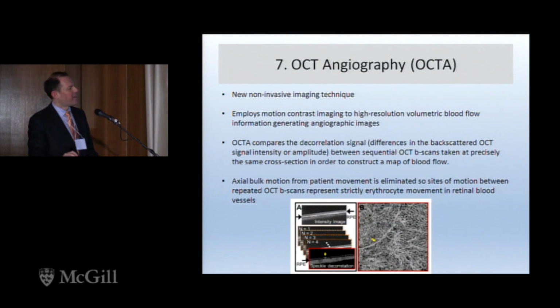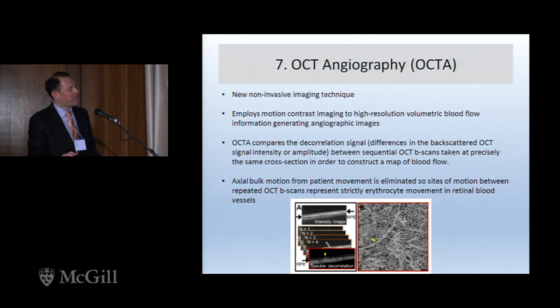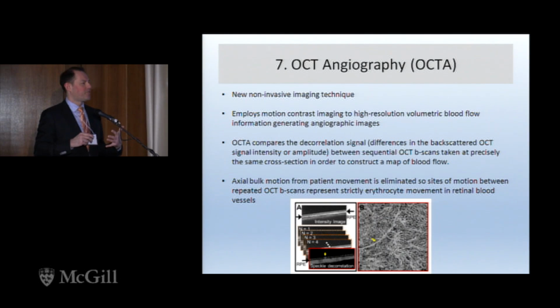I'll skip over that. And the last point I'll make is OCT angiography, which we'll hear in a little bit more detail with Dr. Moreno. This is one of the newer non-invasive imaging techniques, and in retina, this is the buzz, because people are looking at this for diseases such as AMD and diabetic retinopathy. And what this does, it employs motion contrast imaging to obtain high-resolution volumetric blood flow information.